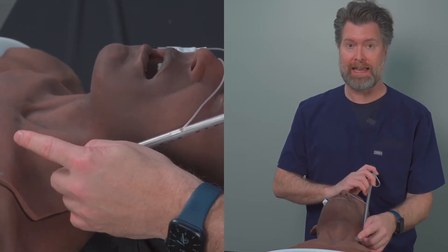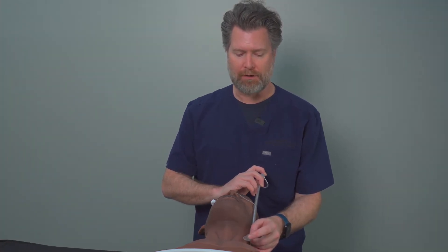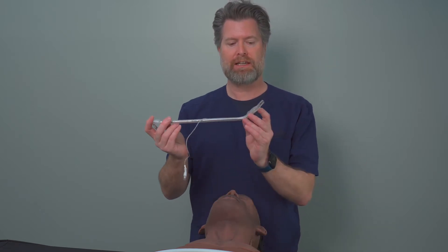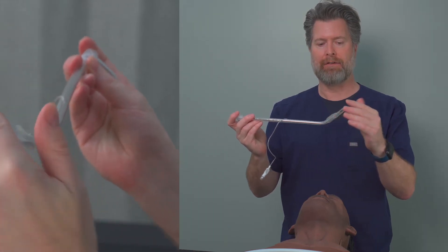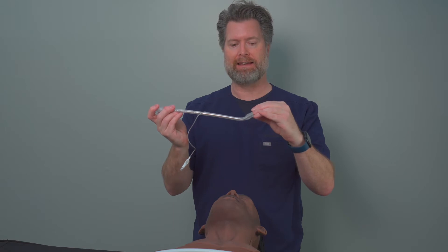Once this tip is at the anterior trachea, one of the reasons why I don't like it when the stylet is all the way at the edge of the tube is because then this tube becomes rigid and you can't move it. But if you see here, because I've recessed the stylet just slightly, this allows for this tip to remain soft, and that will allow it to kind of hit the anterior tracheal rings and then soften and be able to slide down into the trachea.